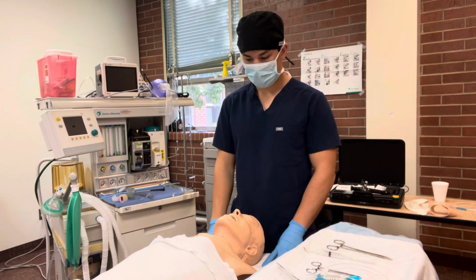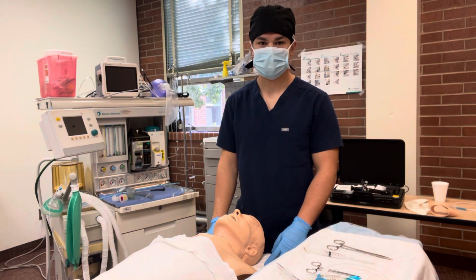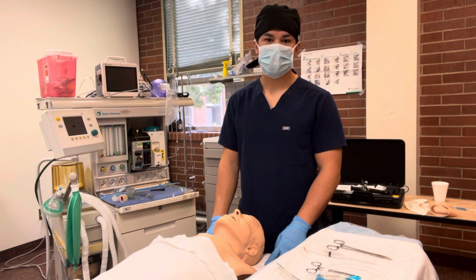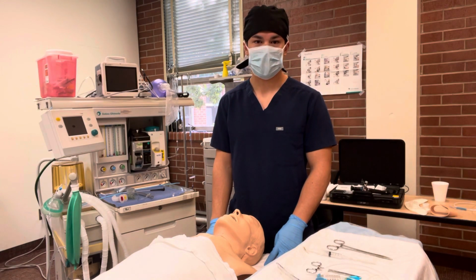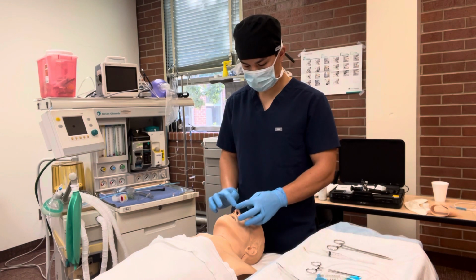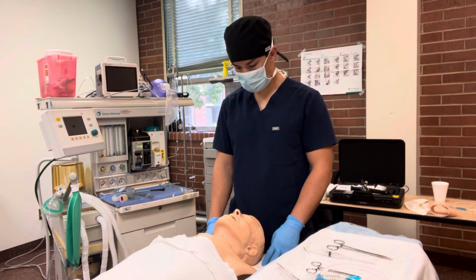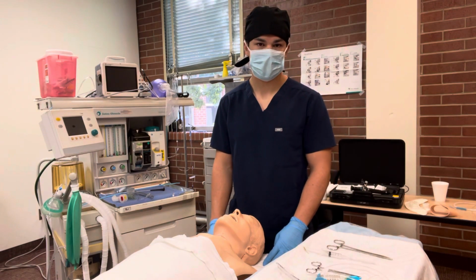If I suspect a difficult airway in my patient, I'm going to grab another set of hands for induction and intubation from another anesthesia provider. I'm going to be thinking about maybe an awake fiberoptic intubation, and with that I'll use nerve blocks to blunt the airway reflexes. I can use ketamine to maintain spontaneous respirations, and I can put on a nasal cannula, turn that up to high flow to do apneic oxygenation, and I can grab any video laryngoscopes that I would need.